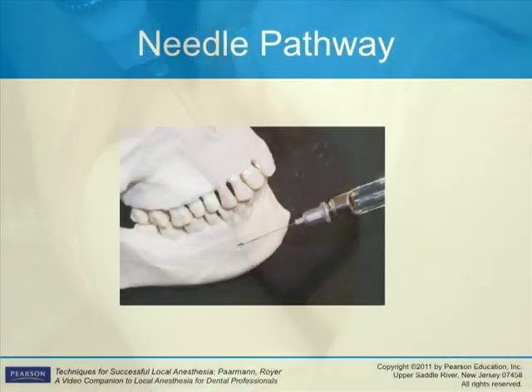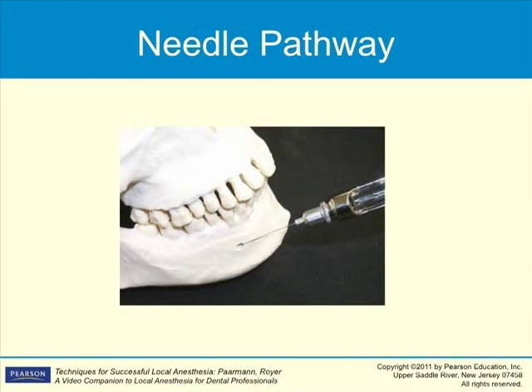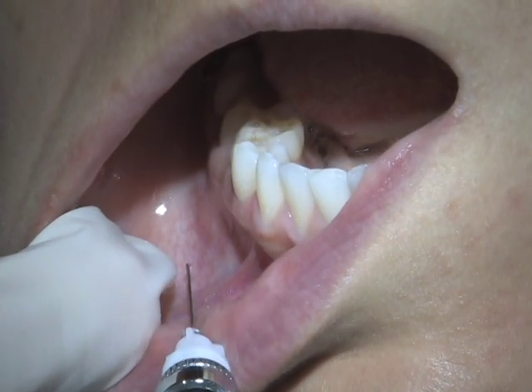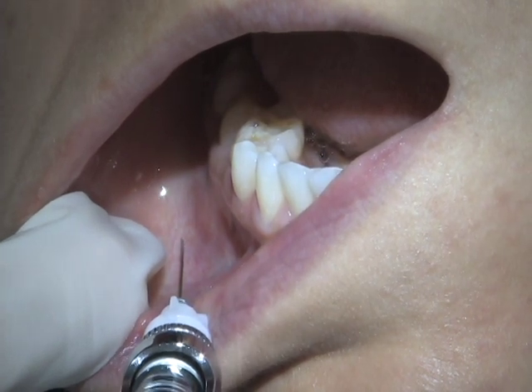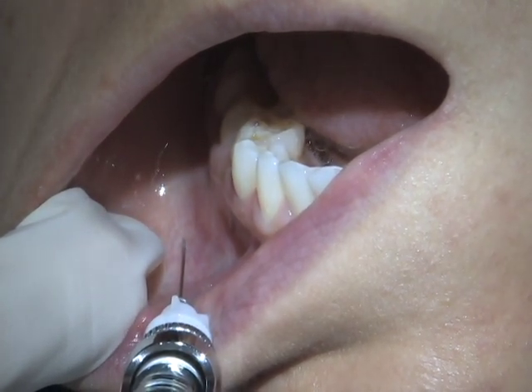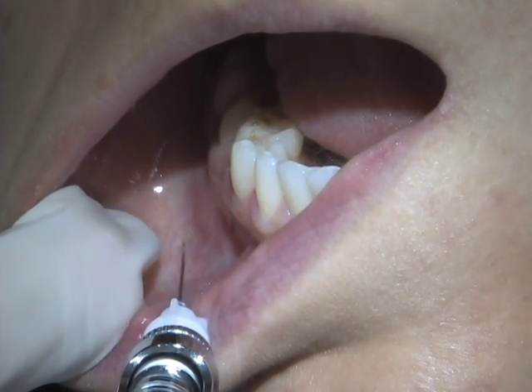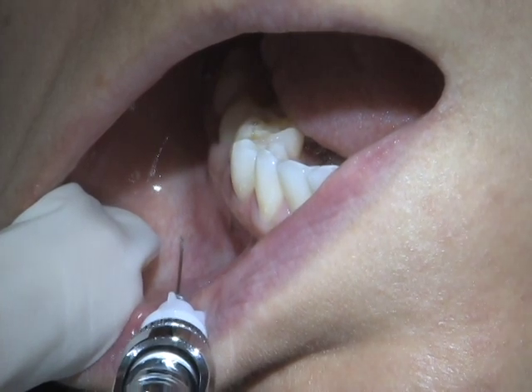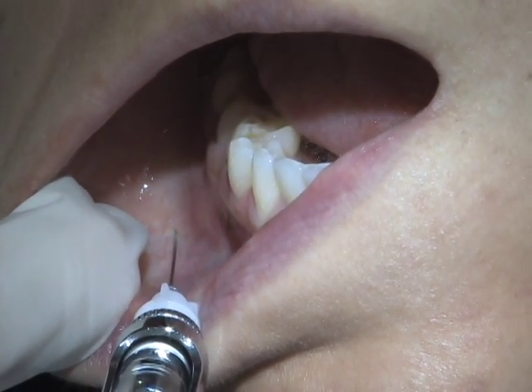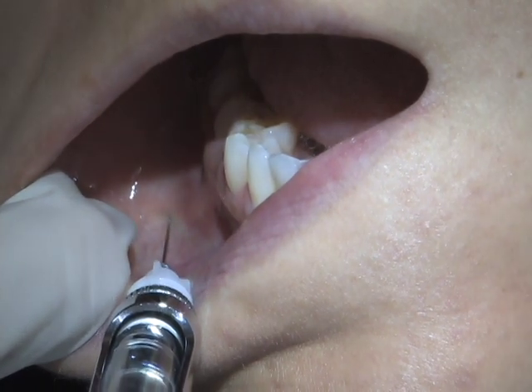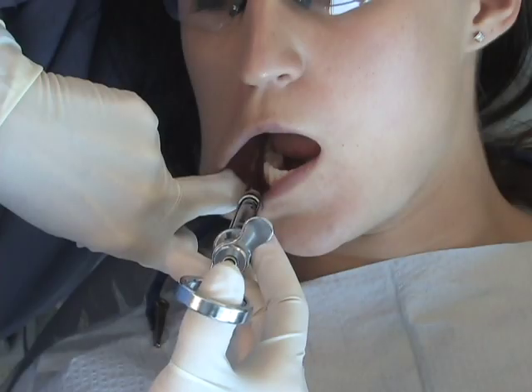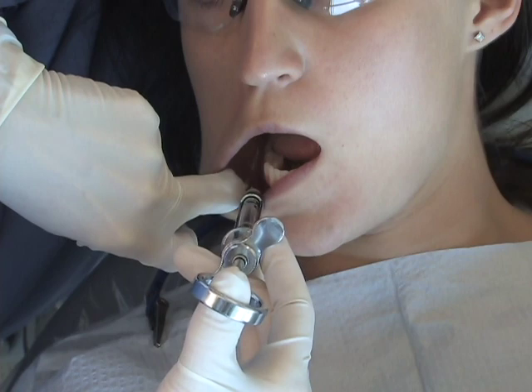Method two: the clinician is positioned in front of the patient. Retract the lip and keep the syringe as parallel as possible with the occlusal plane. Insert the needle at the depth of the vestibule approximately four to six millimeters, so the needle will be directly over the foramen when the anesthetic is deposited. Aspirate and deposit solution.